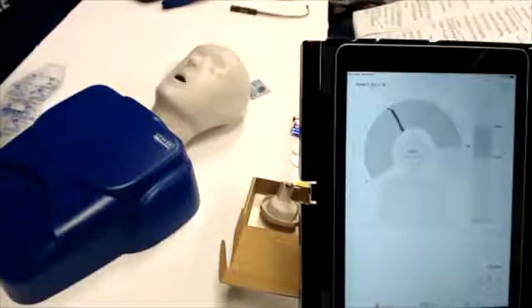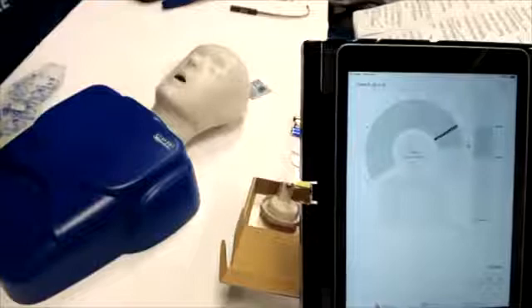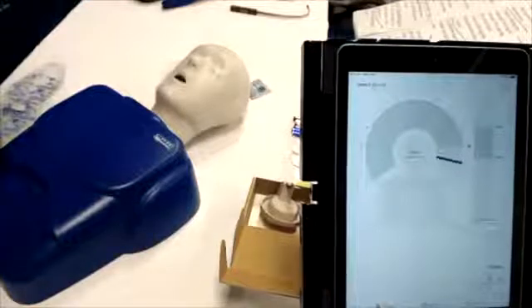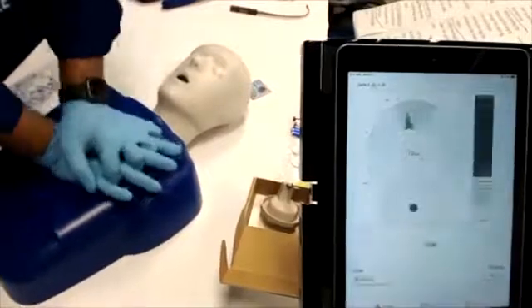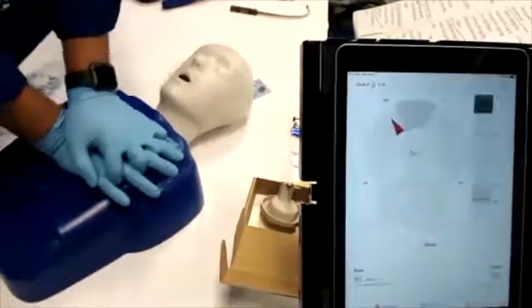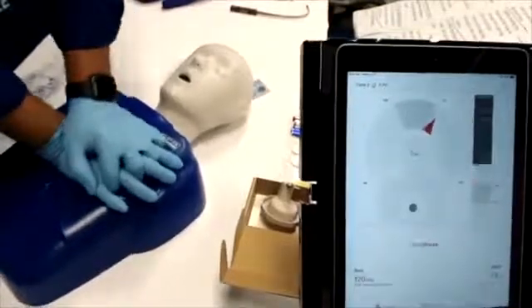The depth is the visual bar on the right with the recoil bar at the very top. The meter will illuminate green and red, reflecting good versus bad performance. Shading offers guidelines for minimal and maximal performance, as selected by the instructor.